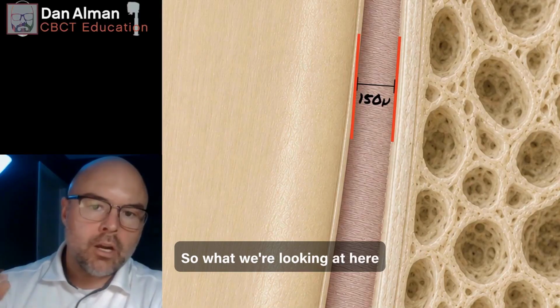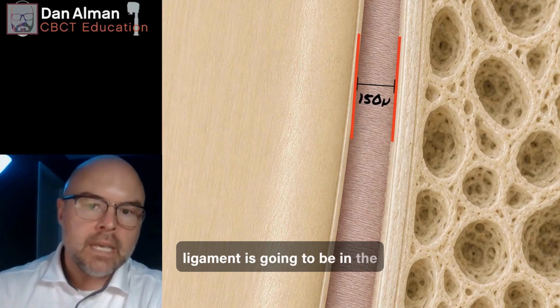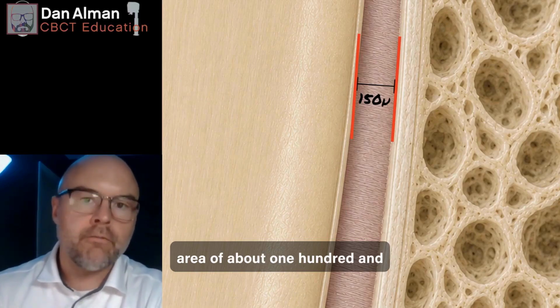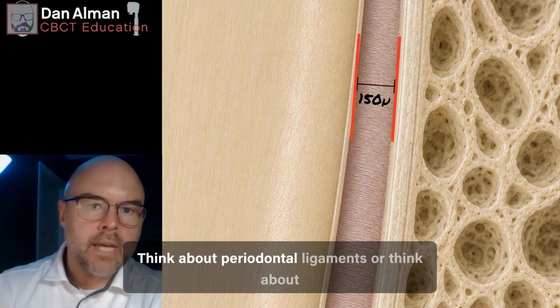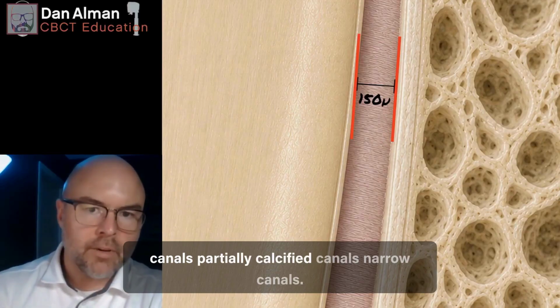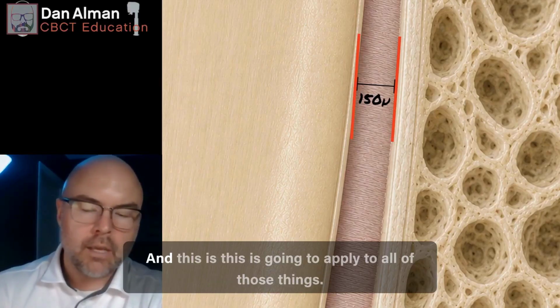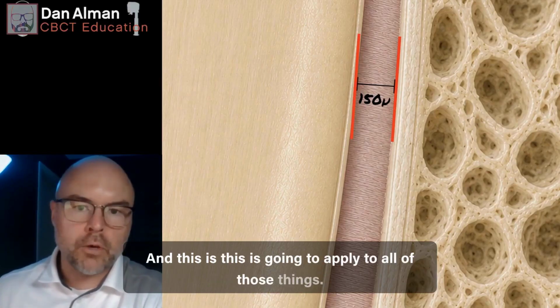So what we're looking at here are a small periodontal ligament is going to be in the area of about 150 micron. Think about periodontal ligaments, or think about canals, partially calcified canals, narrow canals, other smaller structures. Okay, and this is going to apply to all of those things.